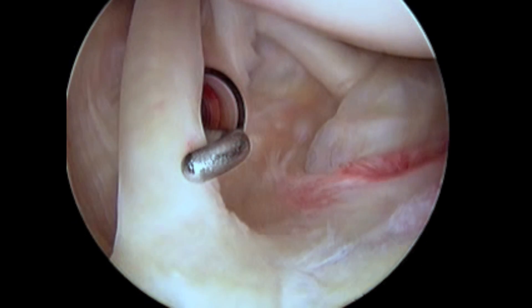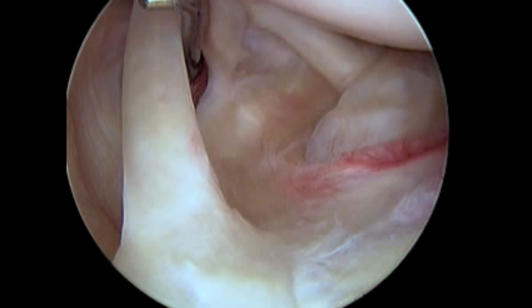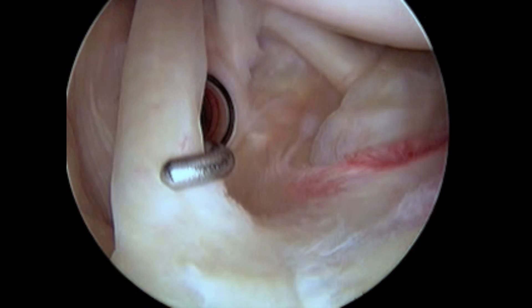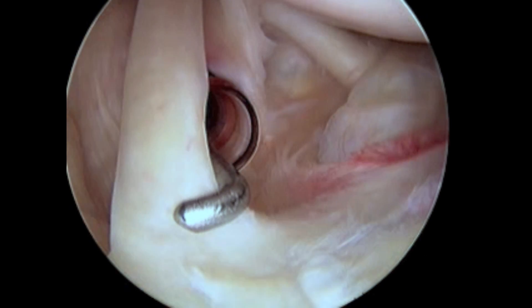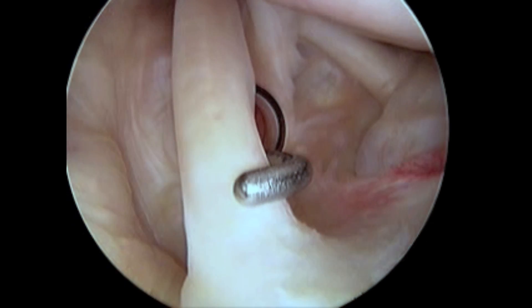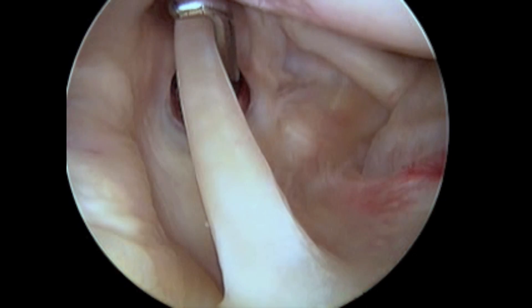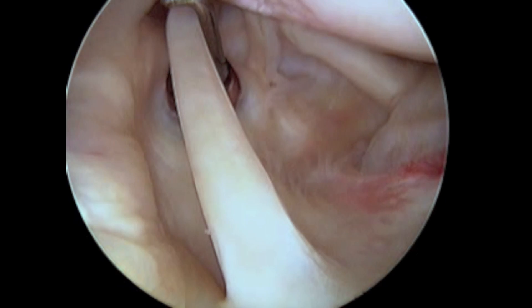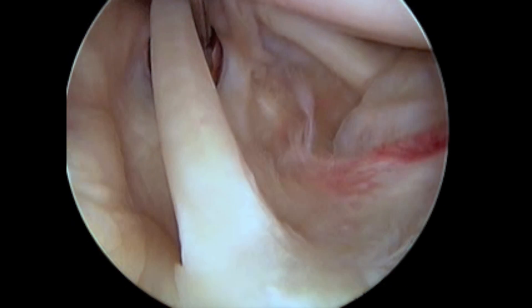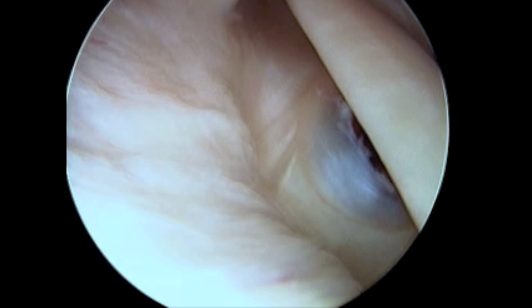The first structure palpated is the long head of the biceps tendon. Although anatomic variation in the interarticular appearance does occur, this shoulder demonstrates the typical origin of the biceps from the supraglenoid tubercle and the superior labrum. The biceps then travels anteriorly where it exits the shoulder joint and enters the bicipital groove, as seen here.